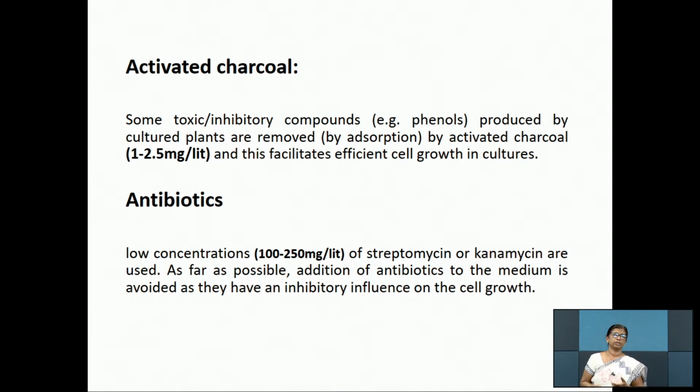Also, antibiotics are the same way. A low concentration of antibiotics, that is 100 to 250 milligram per liter, either streptomycin, kanamycin or ampicillin, any antibiotic can be added based on the expected contaminants in the medium. As far as possible, addition of antibiotics to the medium should be avoided, but you can go for treatment of the explants using the antibiotics.